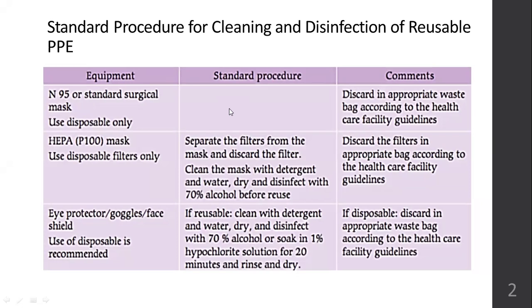Standard procedure for cleaning and disinfection of reusable PPE. Personal protective equipment which you can reuse, which can be used again. For those instruments, how do you reuse it? What should you do to reuse it?